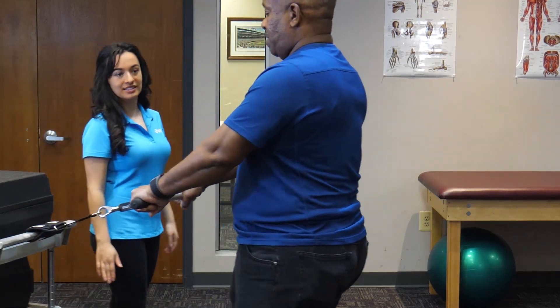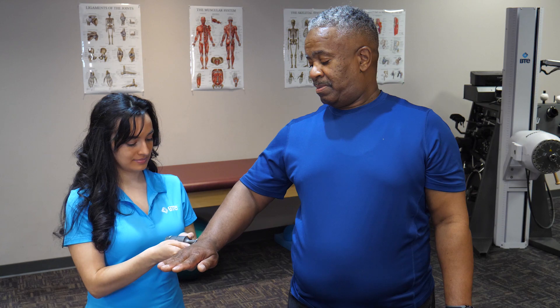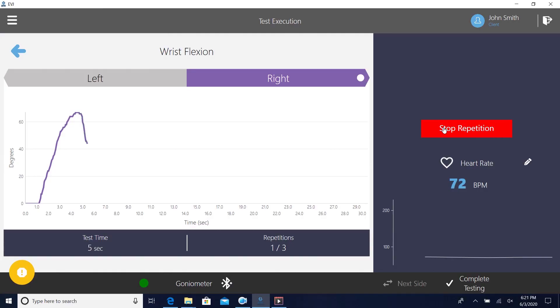Regardless of the instrument being used, the EVJ continually monitors heart rate to track your client's physiological response. Whatever your goal, the EVJ helps you achieve it with precision and ease.